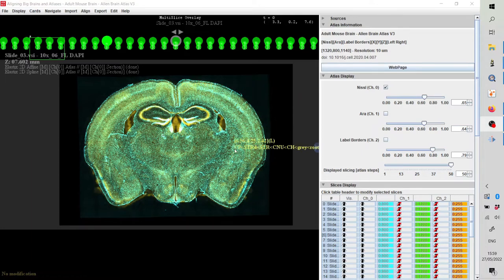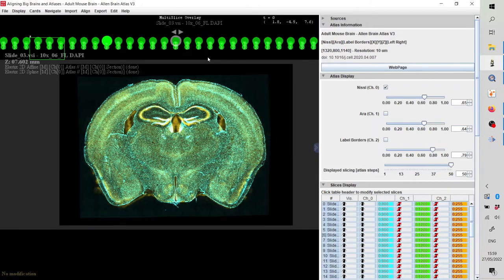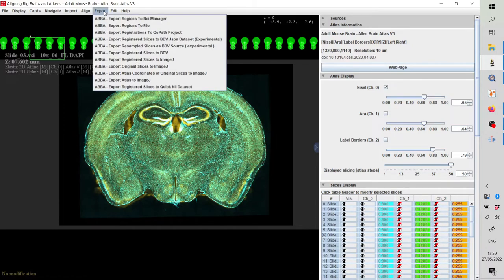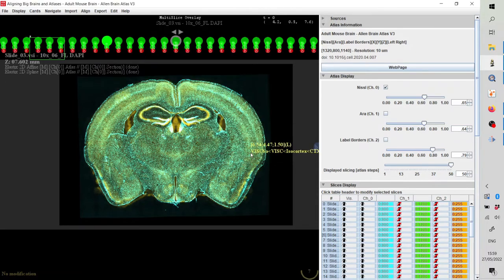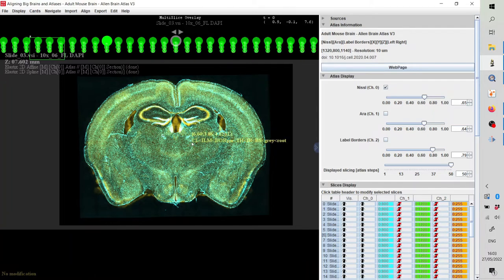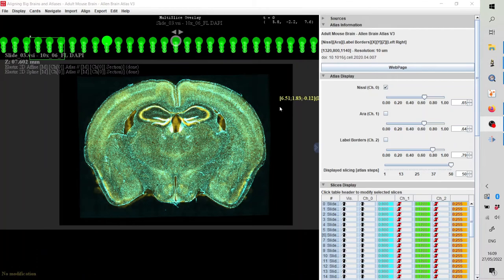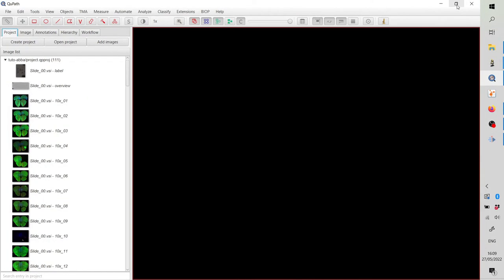I will stop the registration here. But it's also possible to add another spline transformation on top of this. So you can add many spline transformations. It's just that at some point you need to ask yourself whether you are not deforming too much the slice to make it match. And this only a lot of experience in the domain will prevent you from doing mistakes. Now that the registration is done, I can export the results to the QPath project. And for that I simply need to select all slices again. And click export. Export registration to QPath project. I click OK. And it will take again a bit of time to process the export. So I will speed up the video. All the export jobs are done. I can now go back to QPath where the project is still open.